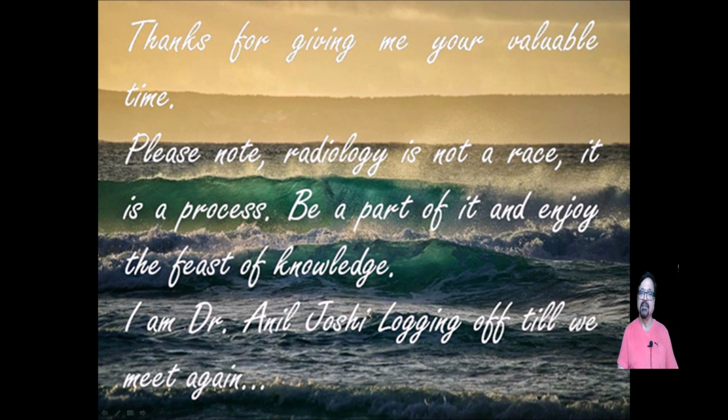Now in this we have seen a technique which was once very popular when there was no ultrasound, when there were no CTs and no MRI. This technique was doing a majestic job for detection of malignancies. So it is important for the newer generation also to know the older technique, what good it was doing, and in case there is any indication for it, we should be able to do it. With this, thank you, take care, do your best for the patient, and be a part of the investigation team to benefit the patient along with the surgeons.